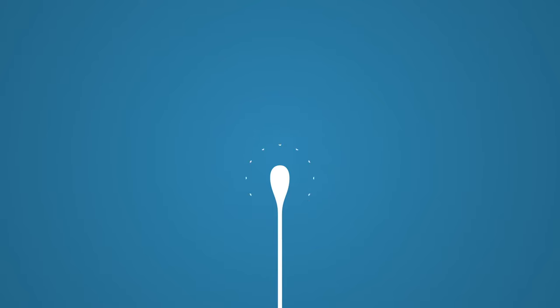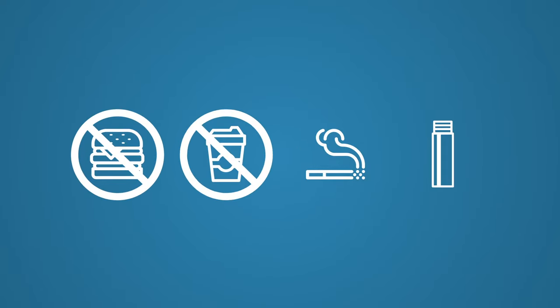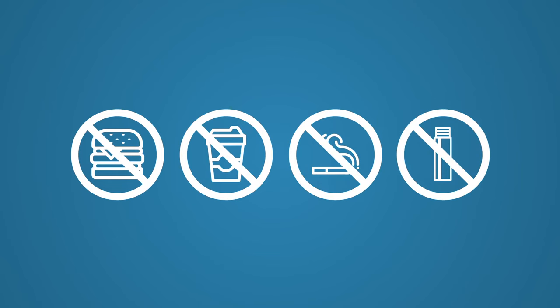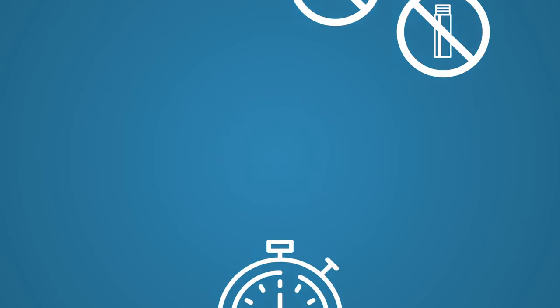The sponge tip should not come into contact with any surface other than the inside of the cheek at any point before, during, or after collection. Do not eat, drink, smoke, or chew gum for at least 30 minutes before collecting the sample.